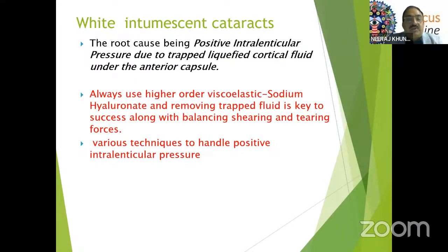Coming to white intumescent cataracts. This is the most important part in capsulotomy because all of us are going to face problems, and whatsoever expertise we have, there will be a chance that we will end up having an Argentinian flag sign. So we should know all the techniques which help us in taking care of the positive intralenticular pressure.